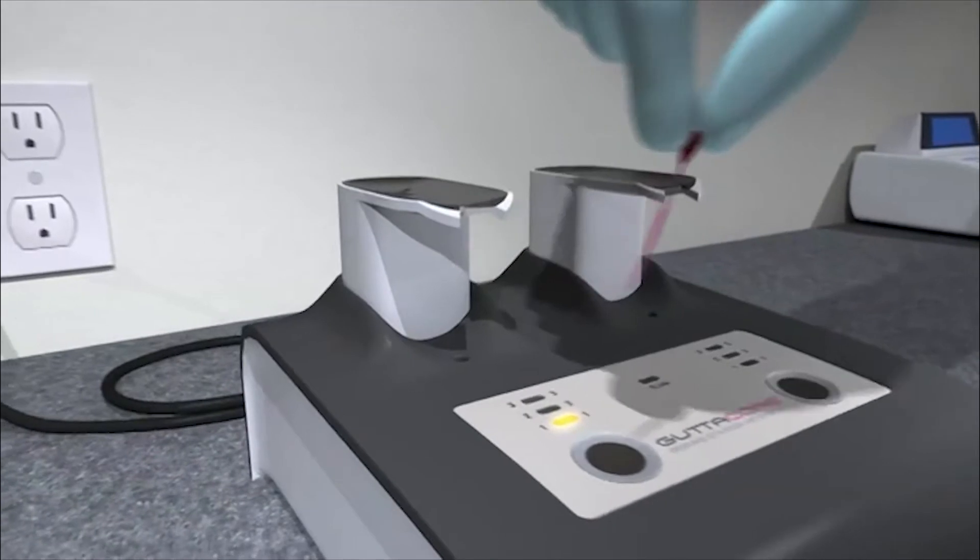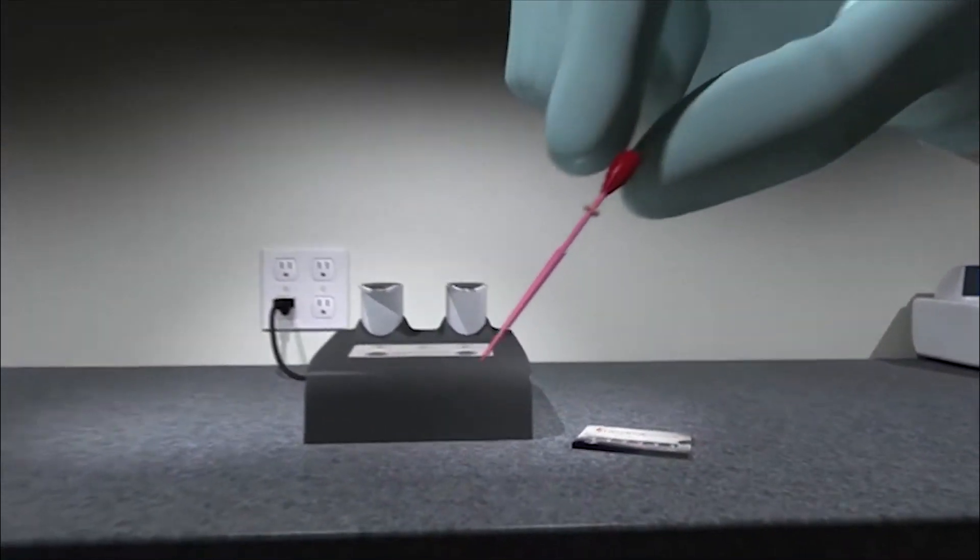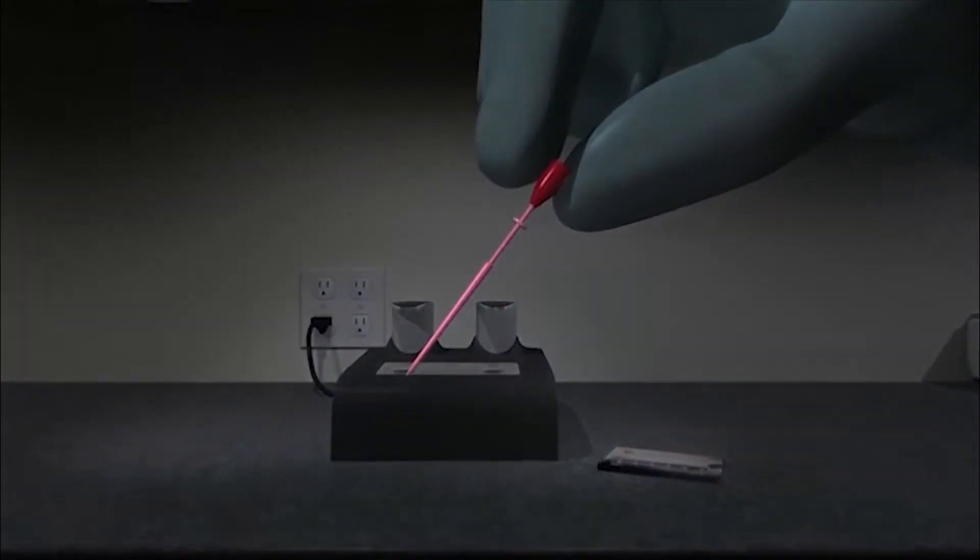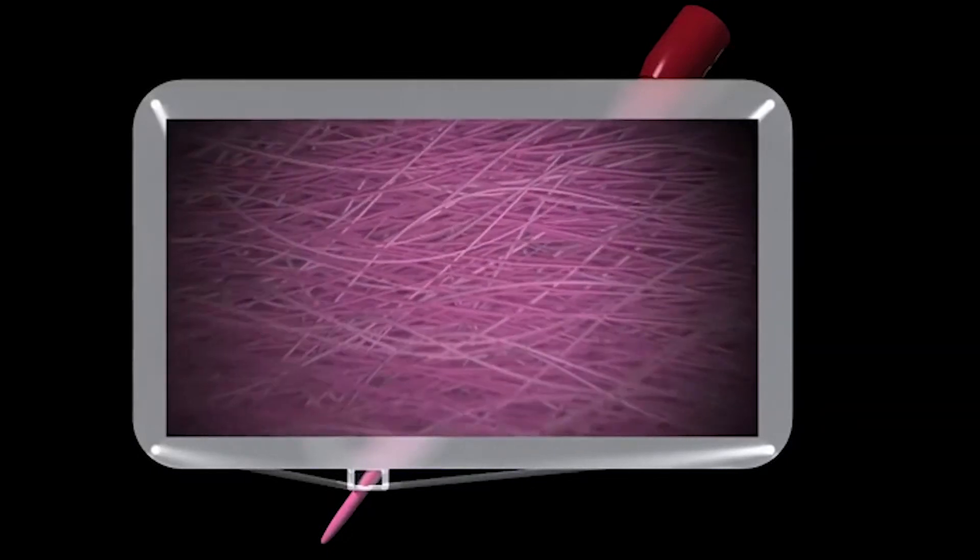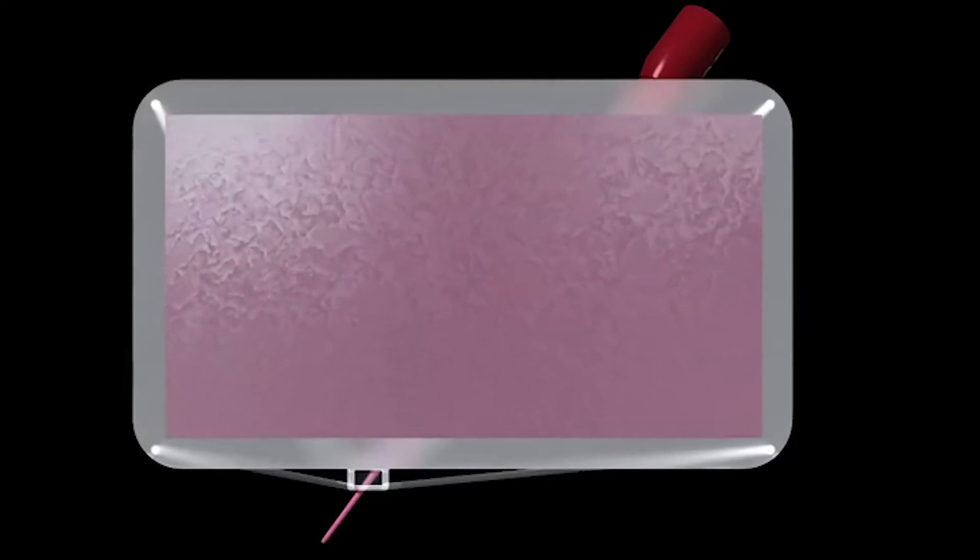Guttapercha Core Obturators are coated with the same flowable alpha-phase Guttapercha that's provided predictable fills for more than 20 years. But Guttapercha Core is changing obturation from the inside out. As the camera zooms in, we see the difference: a pink core made of cross-linked Guttapercha.